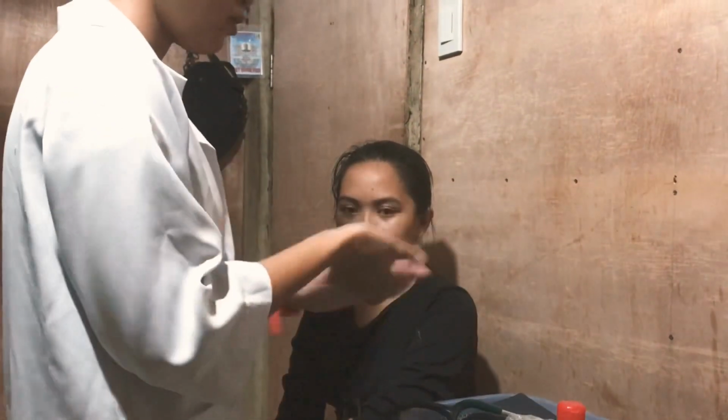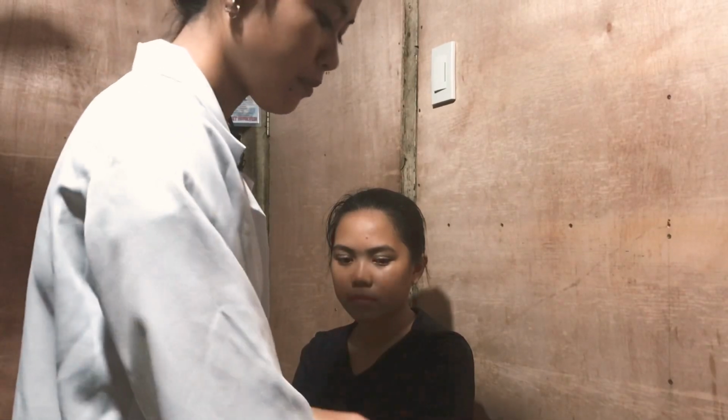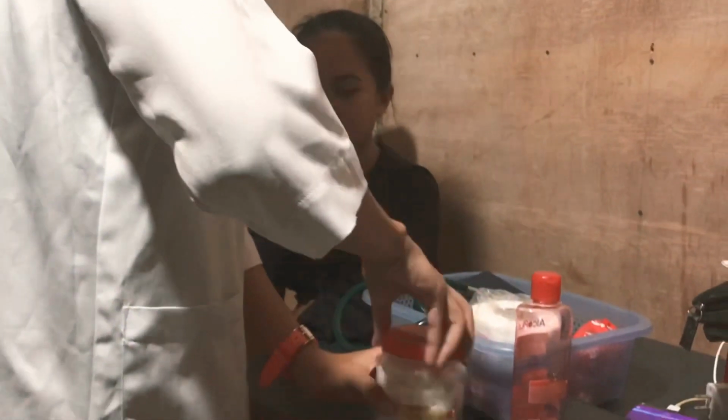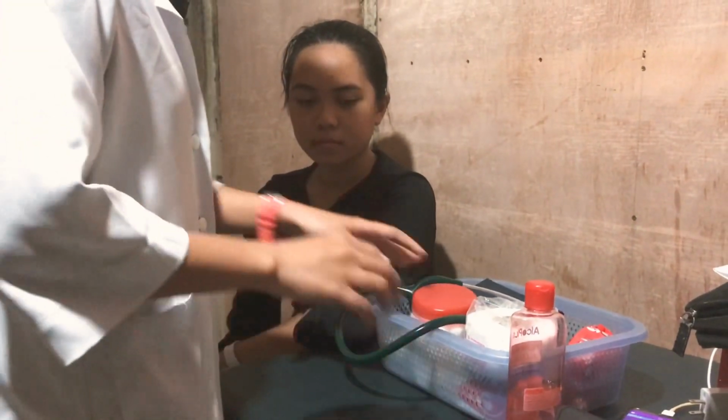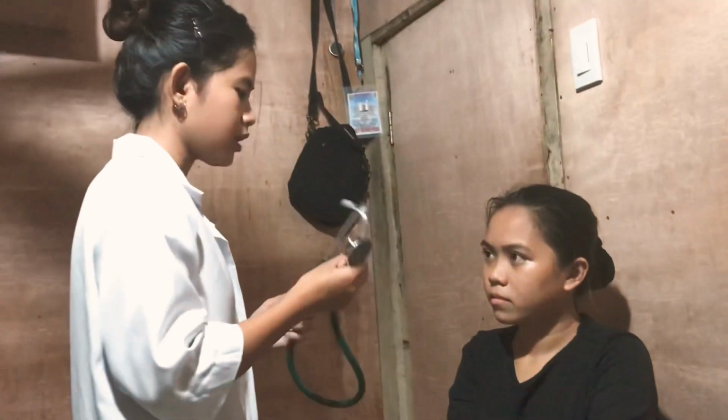Don't forget to do the hygiene. And after your body temperature, ma'am, I will take your apical pulse.